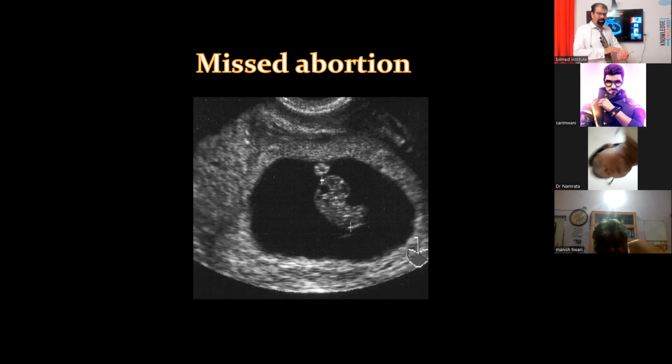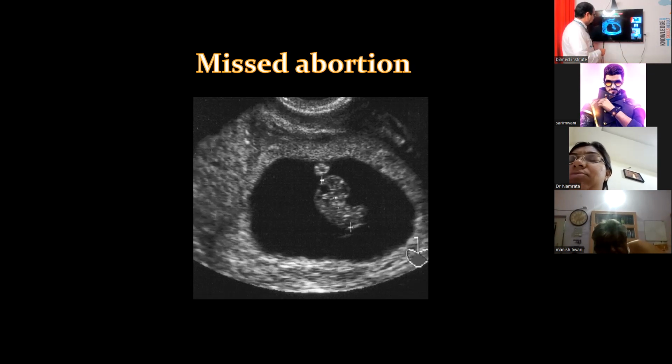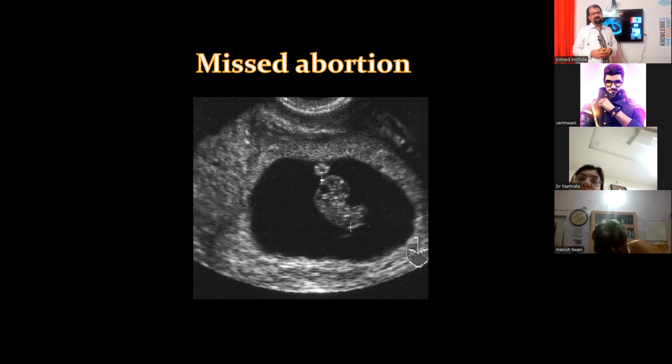Then simply put your fingers onto the maternal pulse, and if it is 72 beats per minute, and that muffled fetal cardiac activity, in inverted commas, is also corresponding with the maternal pulse, then these are transmitted pulsations, not the fetal cardiac activity. Point number one. Point number two: now see in this case, I am scanning and searching for the fetal heart, I am not getting it, and I am now confused whether to label this as missed abortion or not.